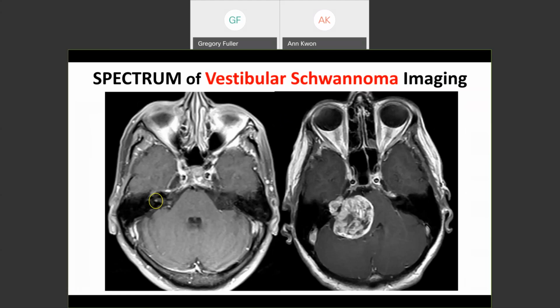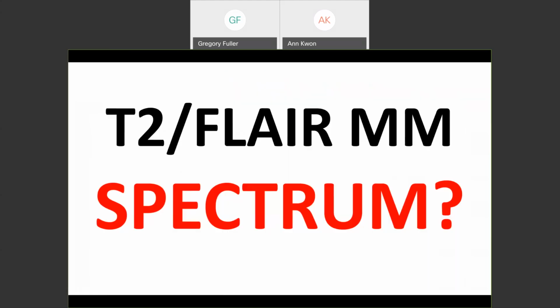So, and again, from the size range, the pathologist, the radiologist has to be able to recognize the full variation and be methodical. Always look at the petrous portion of the temporal bone for these tiny little intracanaliculars. All right, question. The point. What was the point?